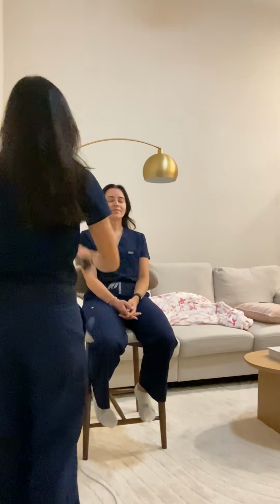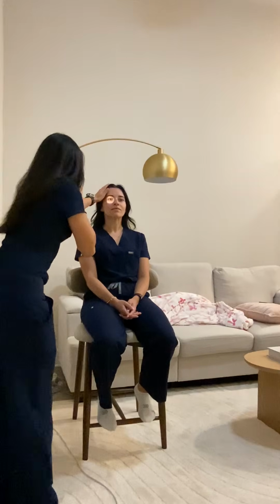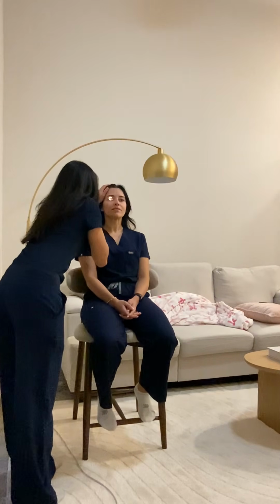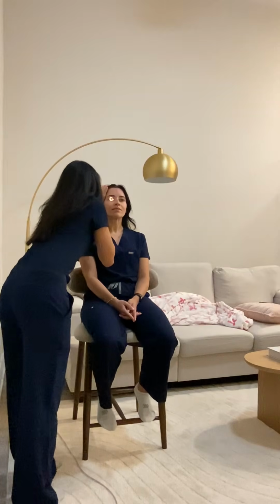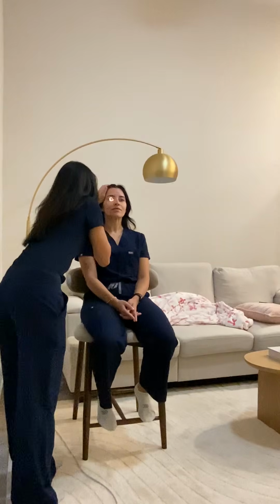And next I will do the same thing on the other side. I have found the red light reflex. I see the optic disc, the cup to disc ratio, as well as I'm able to visualize the retinal arteries and veins and condition.